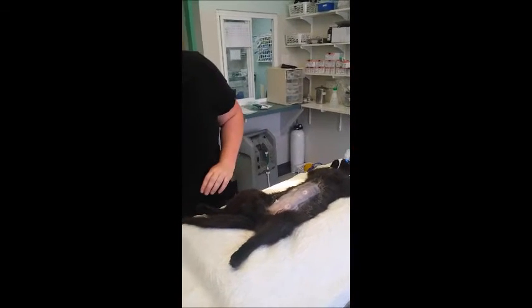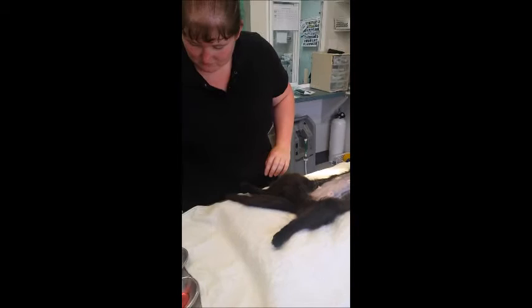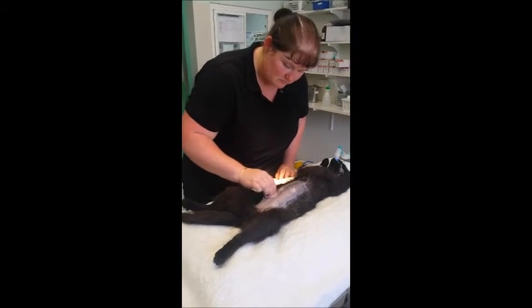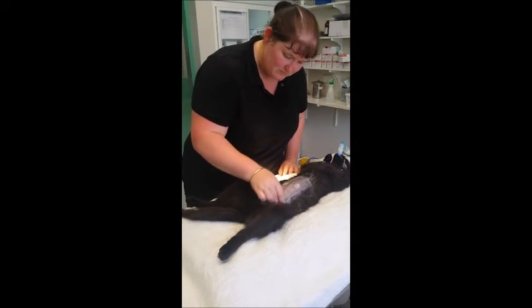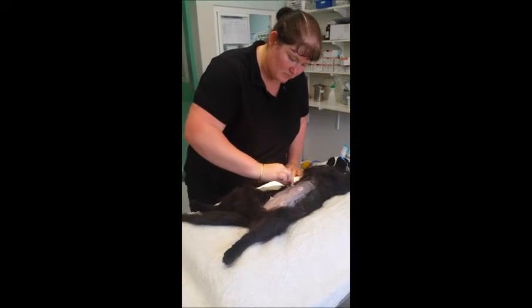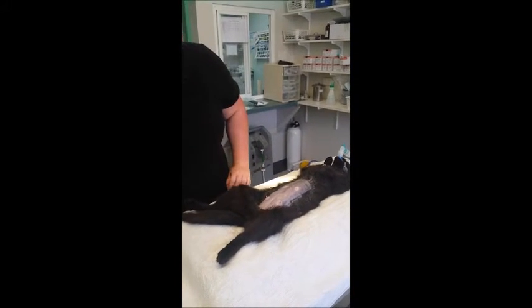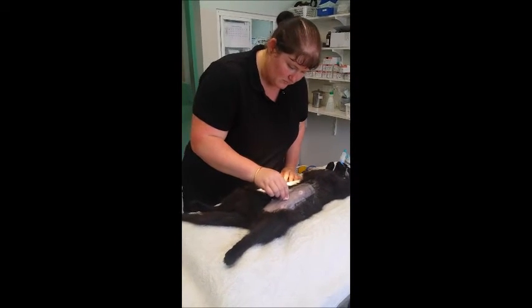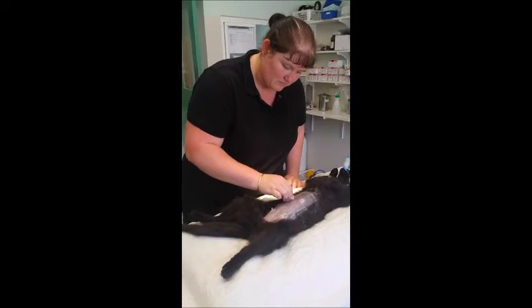Once all the hair is dampened and flattened around the clipped area, I start with my first scrub, always working from the incision site outwards in a bullseye pattern. Ensure that when moving the gauze, it never goes from the outside back into the incision site, as that will contaminate the area. We do each scrub three times.